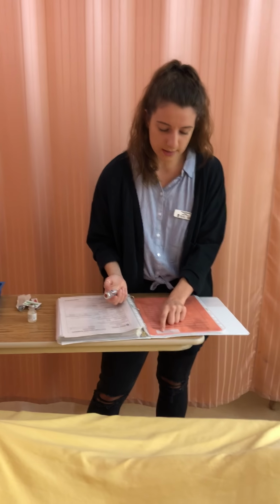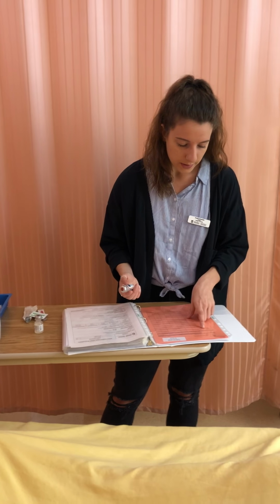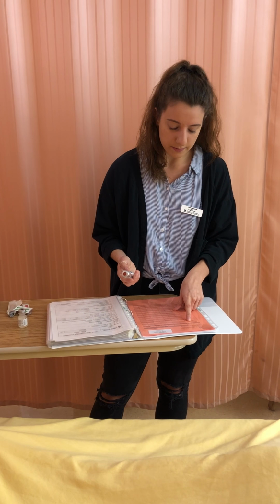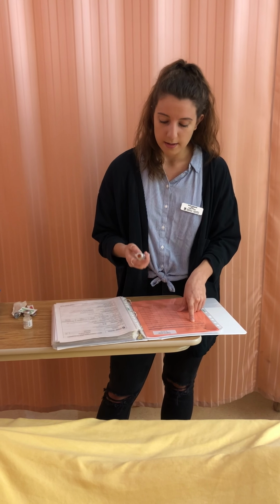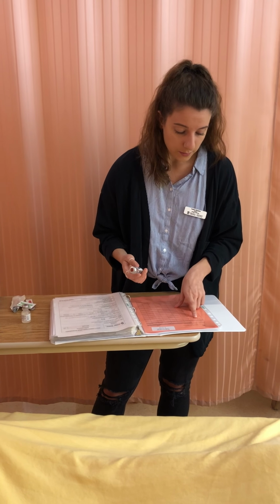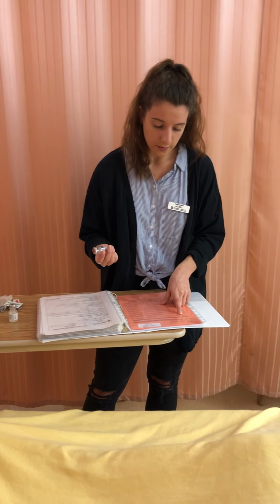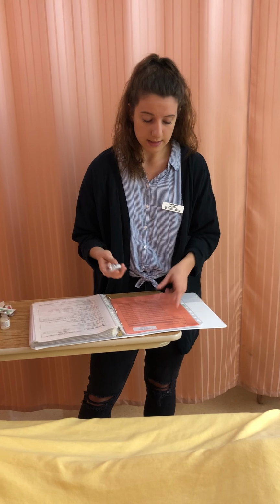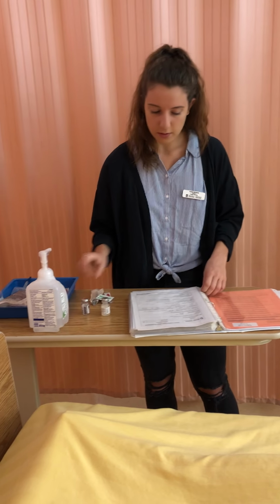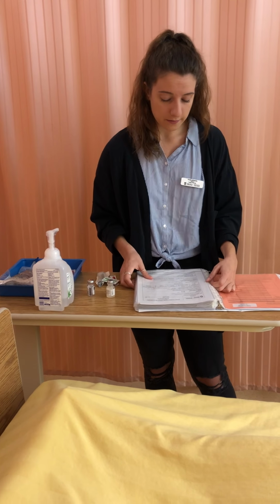So my right patient is Emma Wrightson. The right drug is Zithromax. The right dose is 400 milligrams. This is a 500 milligram vial, so I can get that from here. The right route is IV. This is an IV vial, and the time it's daily, so the time is now at 0900. So I'm just going to go over my drug monograph now.